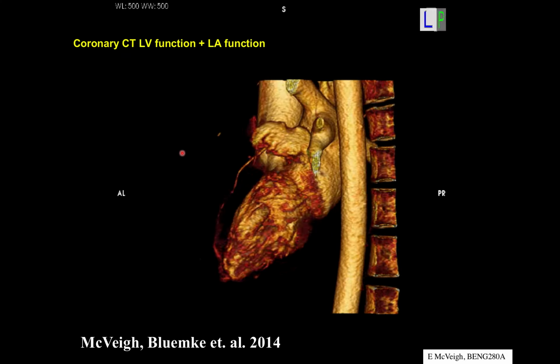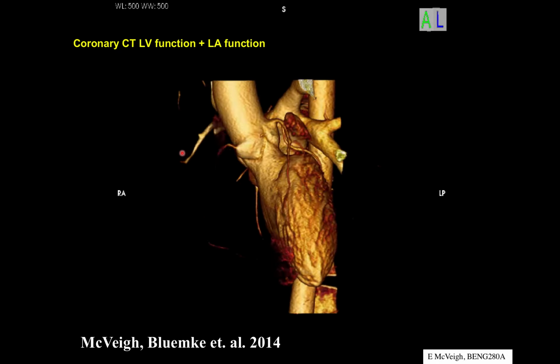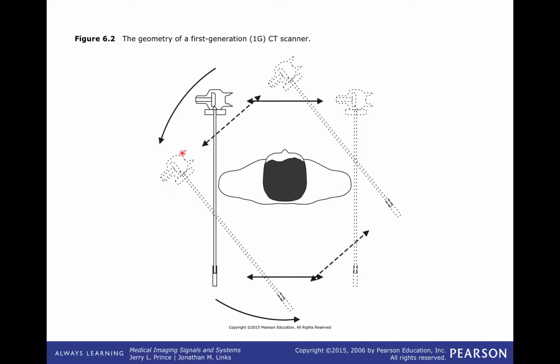medicine is so firmly entrenched in its practice that just discovering something new is quite hard for physicians. It's remarkable. So this has been around for about, I would say, 5 years or something, and still it isn't widely even known to a lot of clinicians that you can do imaging like this. So this is CT data. You can do imaging like that with MR.